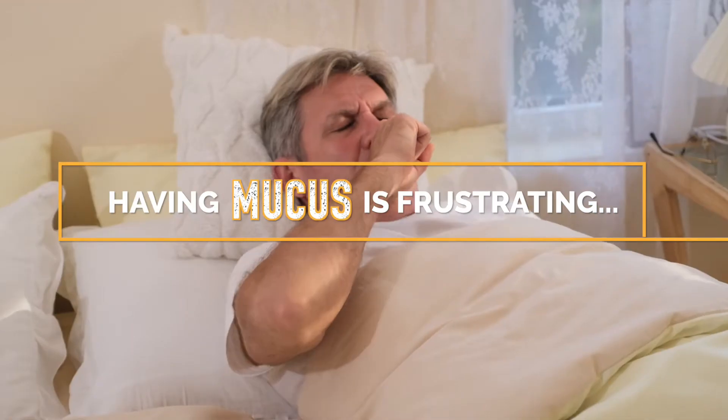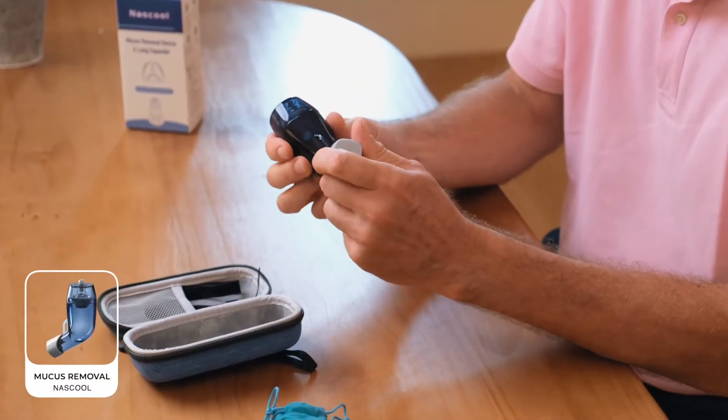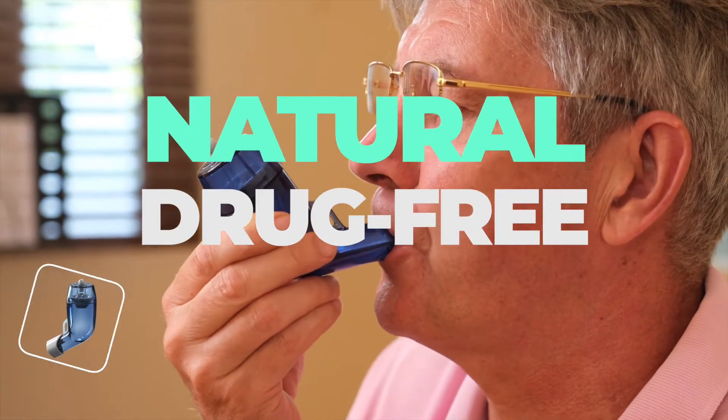Having mucus in your throat is frustrating. We can change it. With Nazcool mucus removal device, you can take care of all your mucus problems with comfort, and it's totally natural and drug-free.